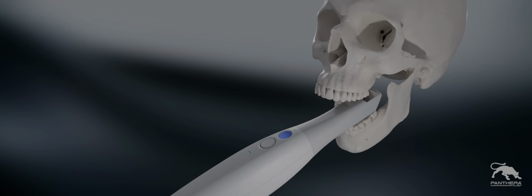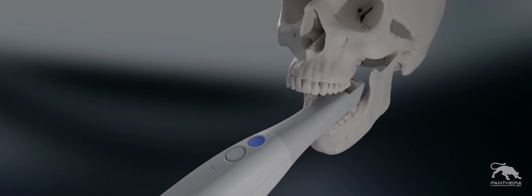Start scanning occlusally with the distal of the last tooth present from a top sextant, and then scan the occlusal surface of the posterior teeth up to the canine. From there, in a back and forth movement, oscillate from the lingual to the vestibular of each of the anterior teeth to the canine of the other arch.